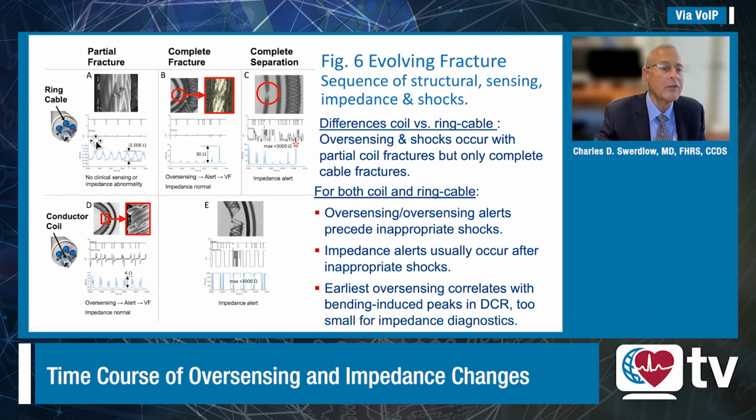And we can see, however, that there's absolutely no oversensing. These signals here, this is the pace sense signal, and this is the input electrogram that simulates an ECG at 60 beats a minute or 1 hertz. This is our first sign of oversensing. And you can see that on the marker channel with the rapid markers and these very low amplitude, discrete, abnormal signals.